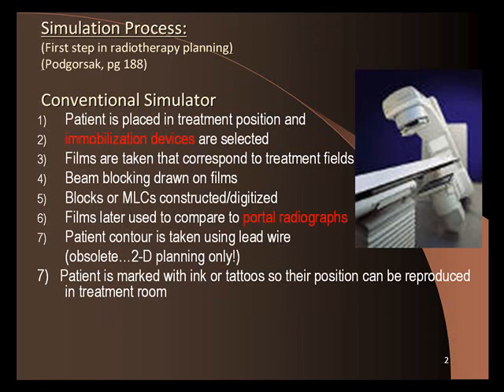I know you guys have been going to Introduction to Radiation Oncology Clinic, and you probably have seen the CT sim, right? A CT simulator. It's a CT scanner. That's a modern CT simulator. It looks like you walk into the room and there's a big device with a hole in the middle and a couch, and the patient lies down and goes into it. Before CT simulators, it was a different kind of simulator.